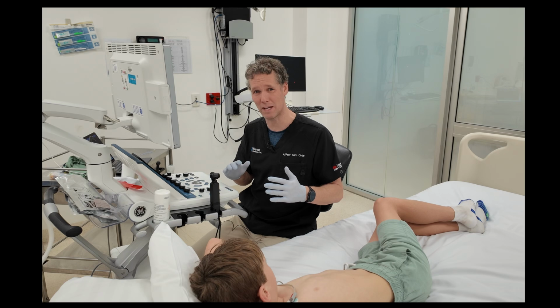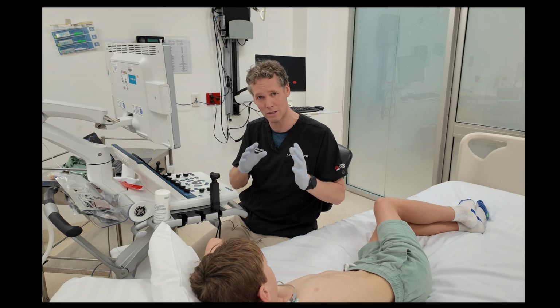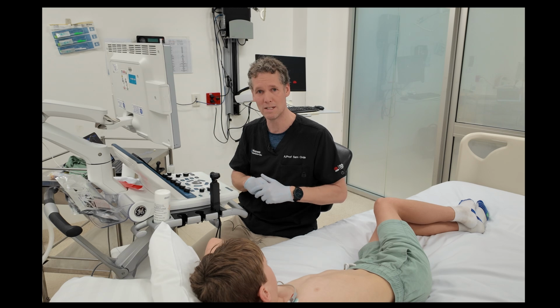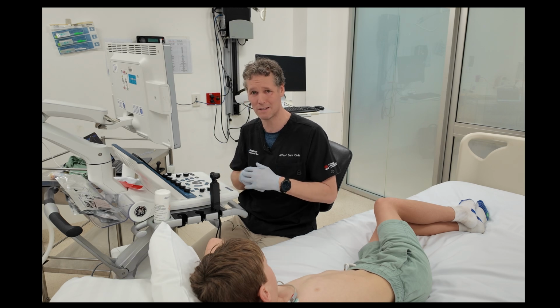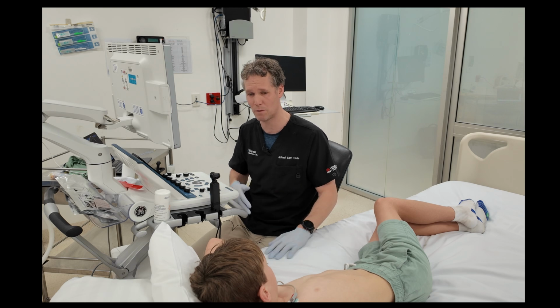There's a pattern recognition. I think the vast majority of 2D echo is about subjective analysis. So trying to recognize those patterns of what LV dysfunction, RV dysfunction, hypovolemia or tamponade look like is what we're trying to determine with echo. It should only take about 5-10 minutes. It should be adequately quick enough that you can integrate it into your clinical management of a patient.